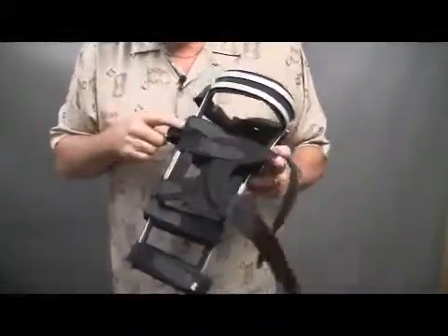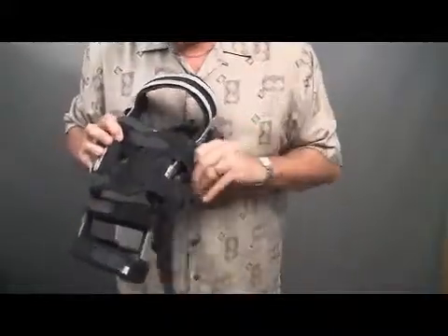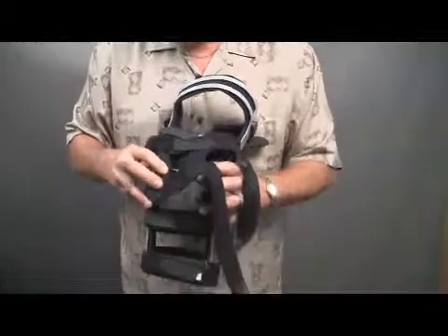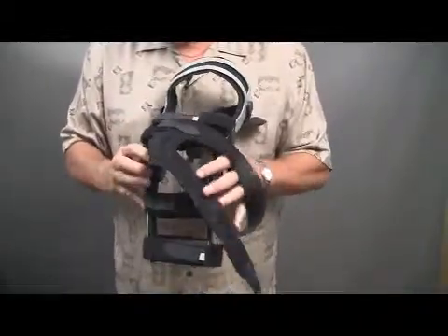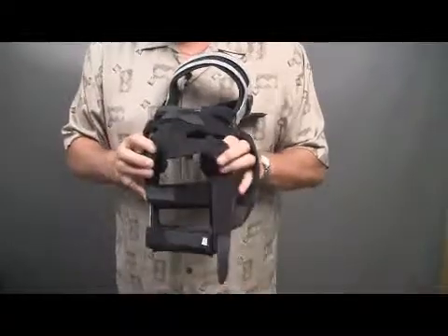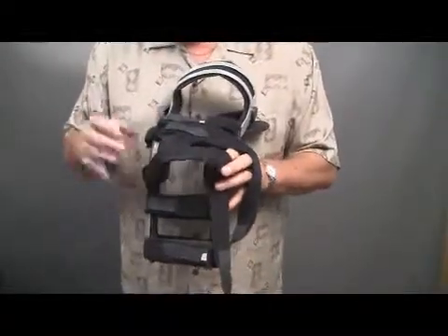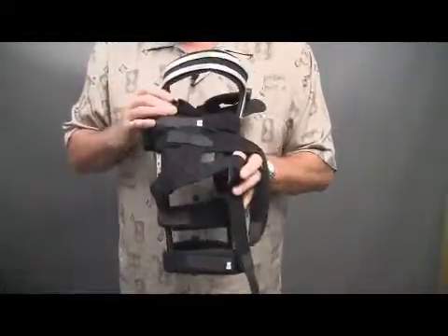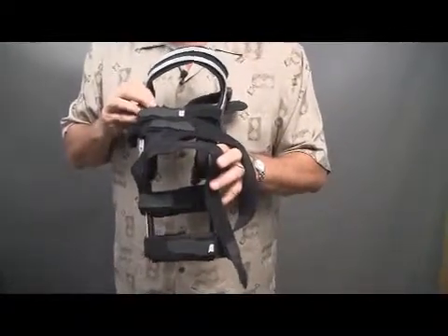These straps wrap around the uprights of the brace above and below the hinge and dynamically pull to one side. So if you've got a person in a functional knee brace who has an ACL or PCL injury, but they also have a patellofemoral injury and they need to control the kneecap as well, this strapping system controls their kneecap at the same time the ACL brace is treating their ACL or PCL injury.